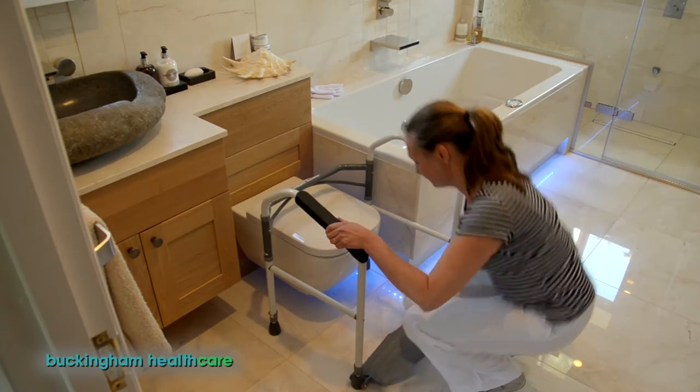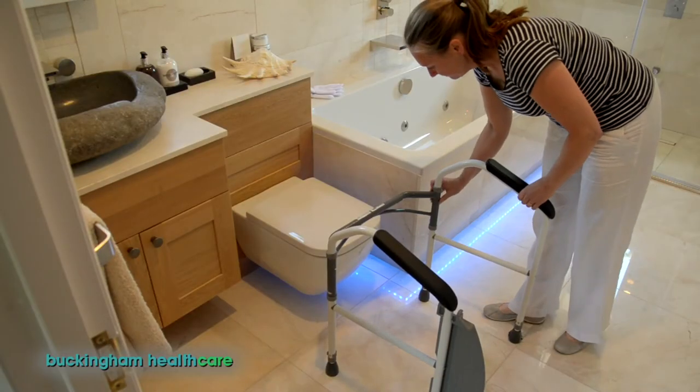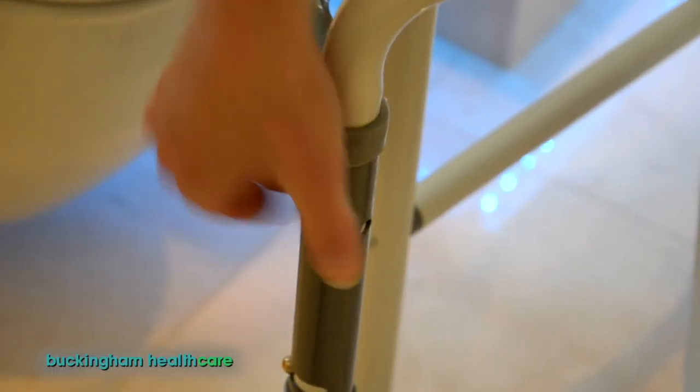Pack your FoldEasy by simply reversing the procedure: footplate back up and clipped on, then splay each frame leg, pinch the spring clips and close the legs back in.